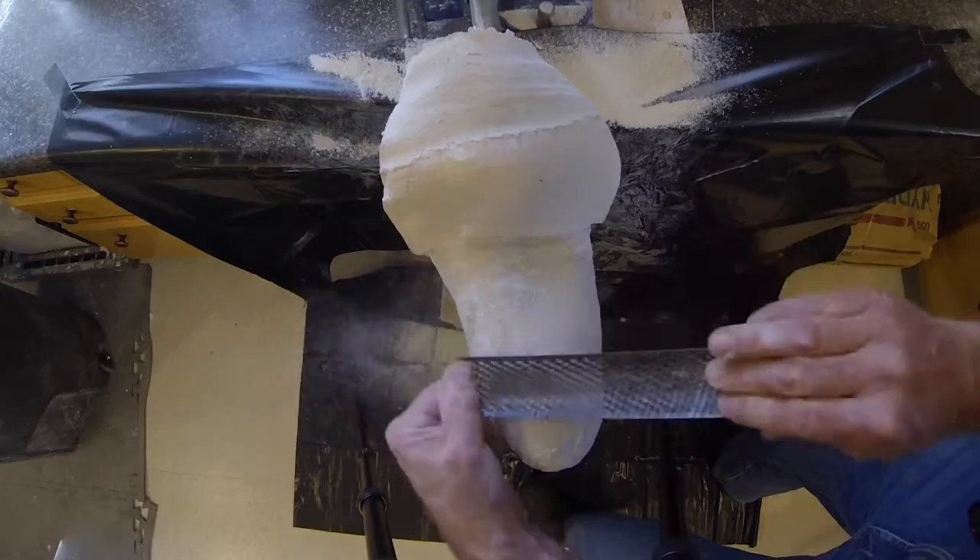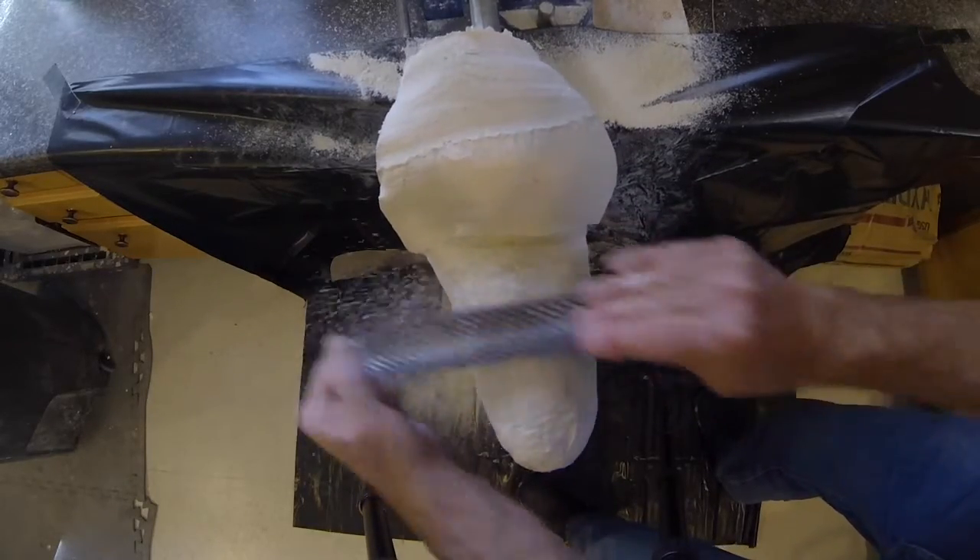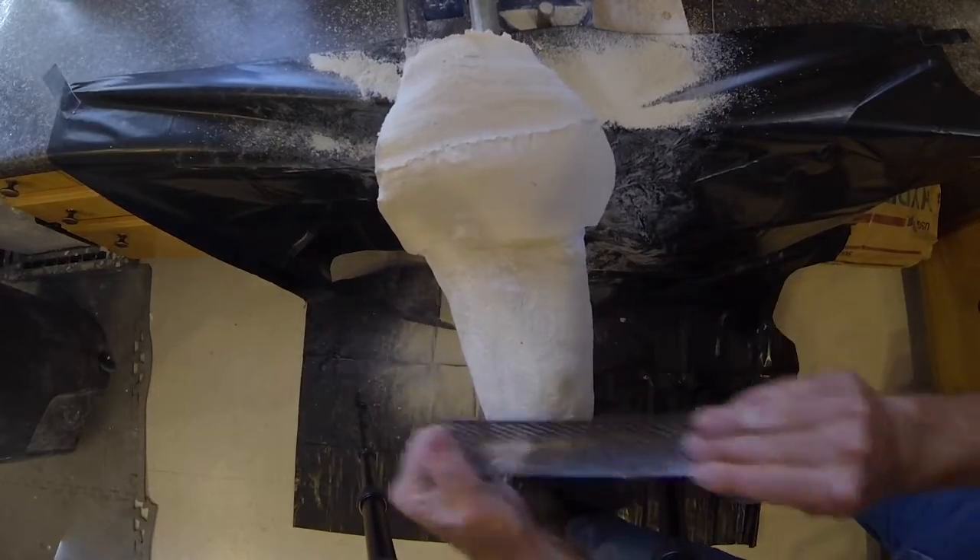Continue the modification on the medial wall. The proximal portion of the medial wall should be relatively flat, allowing the arm to adduct comfortably.